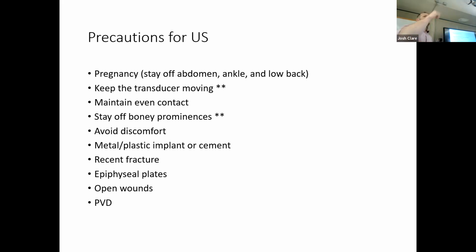Did you have something else, Michaela? Oh, okay. Yeah. Stay away from the sympathetic nerve. We don't want to stimulate the sympathetic nervous system. Thank you for looking that up.